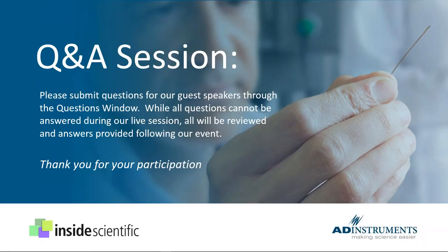I think in this case, they certainly want the PV loops as an independent measure. So transit time, stroke volume, and then use that throughout the procedure, but also use it as a calibration reference. Correct. For your PV loops, and do the full absolute volume calibration as you discussed it. Okay, very good.